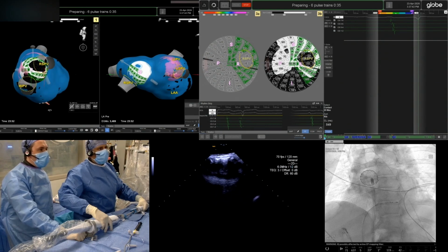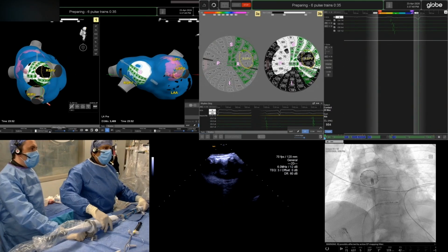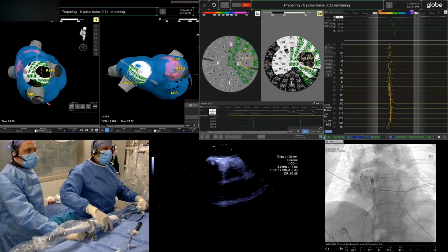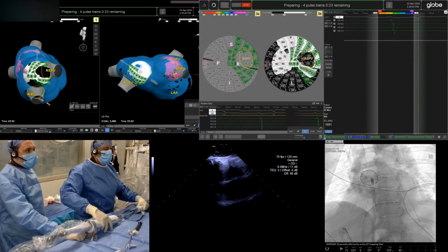But back to your question, as you'll see, PVI with this technology is very good because you know you have contact and you selected the electrodes, and you get very good durability. But it also can be used to do other ablations. Based on looking at that tissue today, I doubt he's going to do any more ablation, but you can certainly do posterior wall ablation.